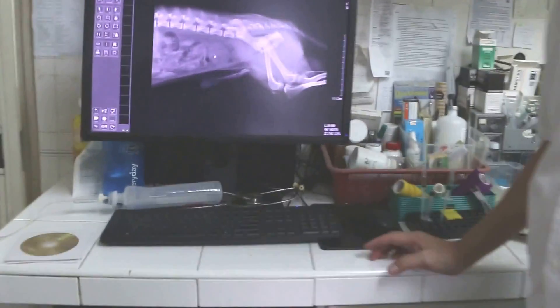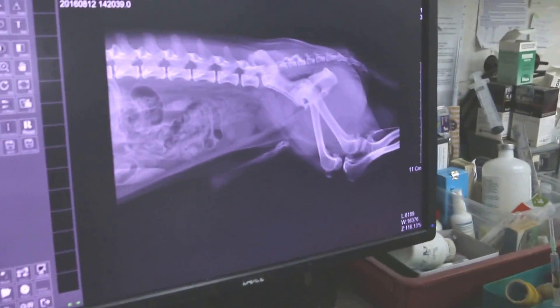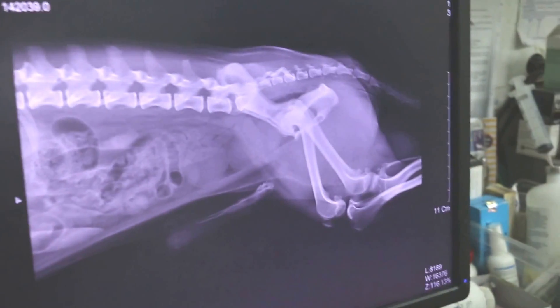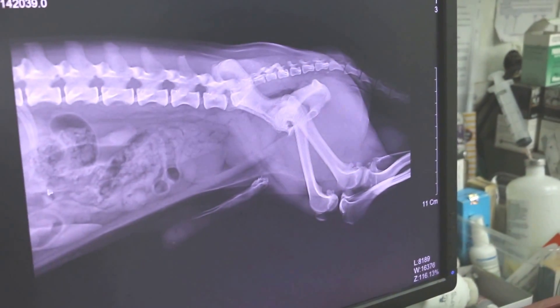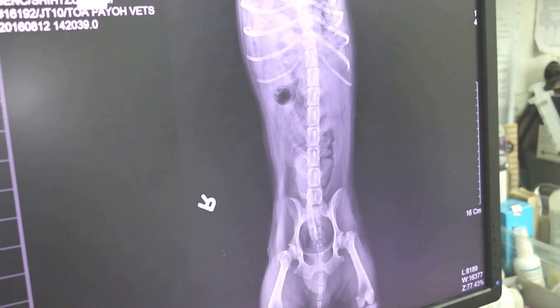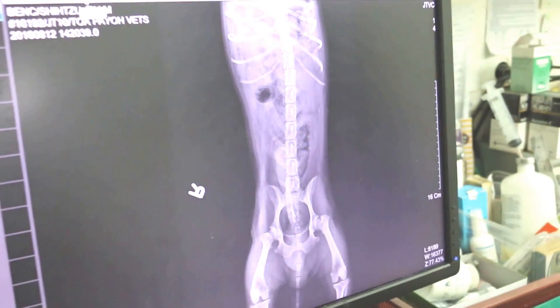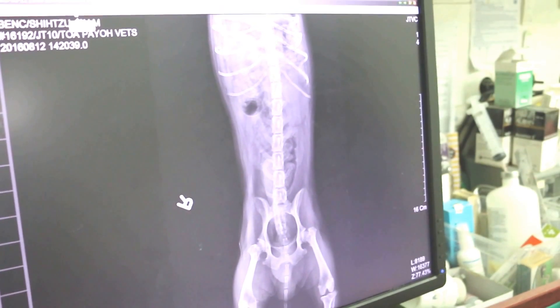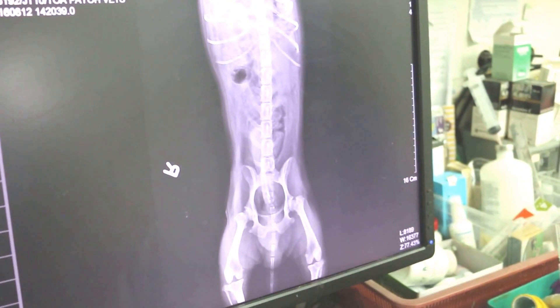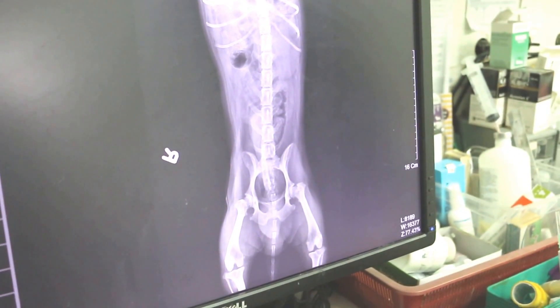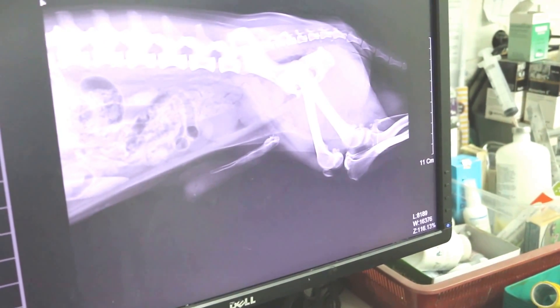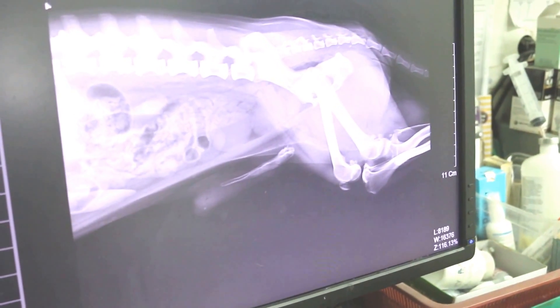X-ray normally we take two views: the lateral view and the ventral dorsal view. You take two views so that you can see the various angles, because if you take one view sometimes you cannot see. So I'm going to the lateral view first — the lateral view of this dog passing blood in the urine.